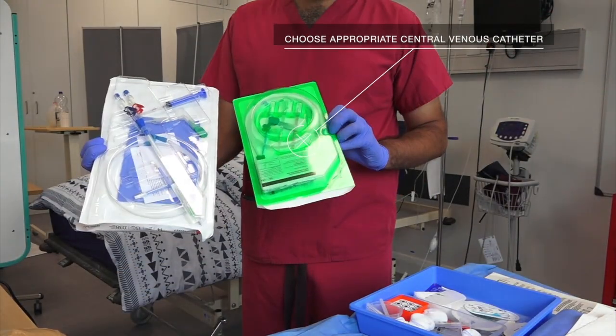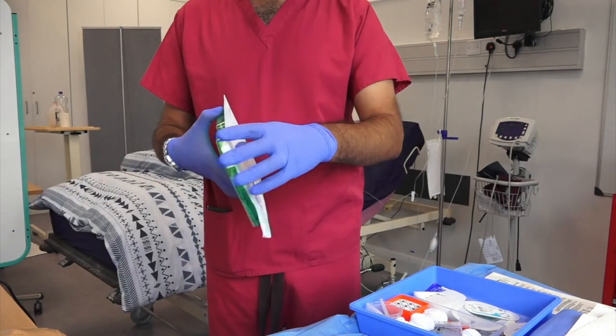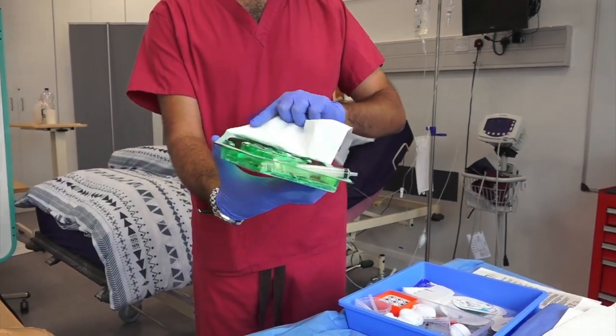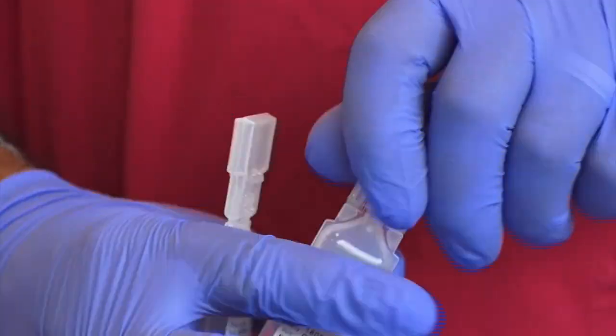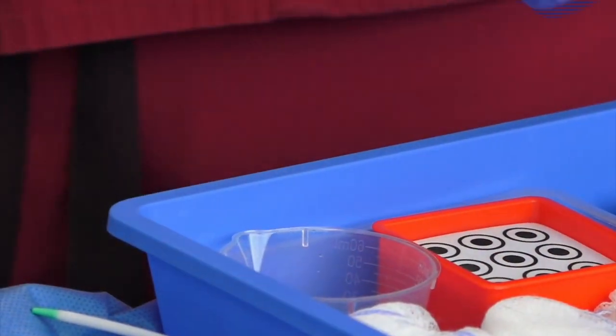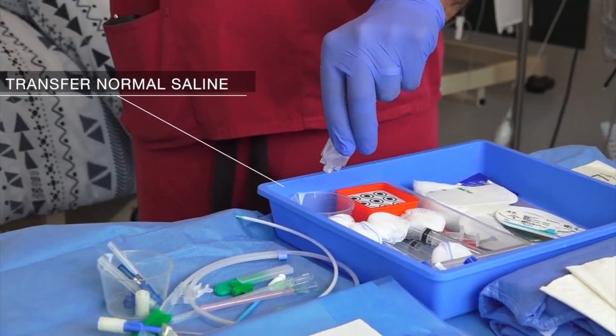Choose an appropriate central venous catheter. The appropriate catheter is the smallest catheter with the lowest number of lumens to meet the patient's clinical needs. Transfer sterile normal saline to a container in the central venous cannulation kit.